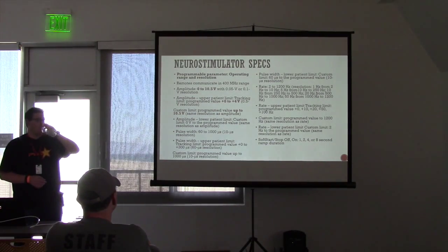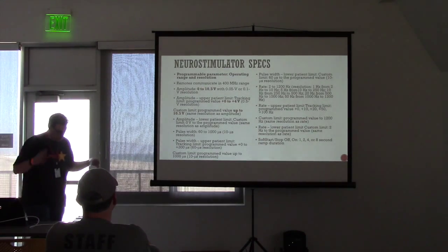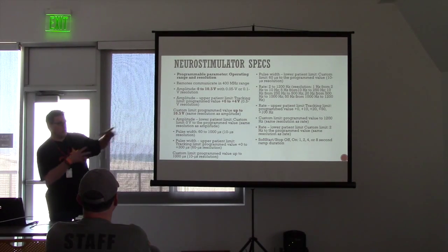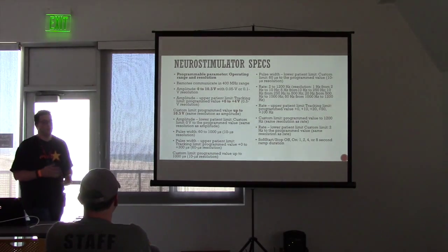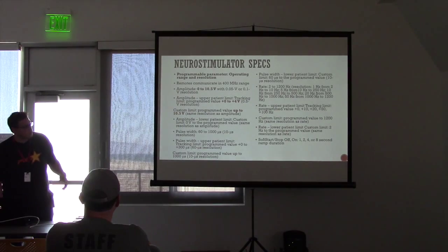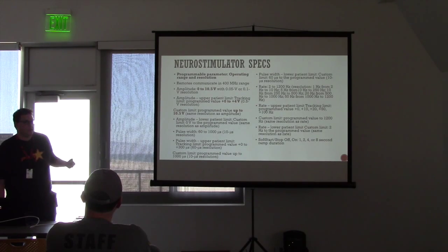So I'm sorry, what's the purpose of the device? Does it send signals to block? Sure. The whole idea is CRPS is where the body is sending pulses out, basically saying, I'm in pain. The pain management device essentially is trying to block that signal from reaching the brain by sending out pulses on the same kind of wave pattern to interrupt it, with the eventual goal of the nervous system resetting and not feeling those pain signals. Unfortunately, doctors don't understand why it happens. They just know that it happens with soft tissue damage. But it is almost like a stroke where it doesn't communicate properly.